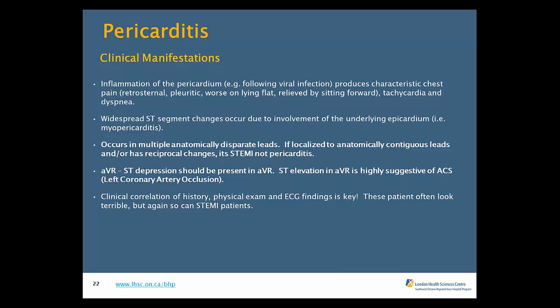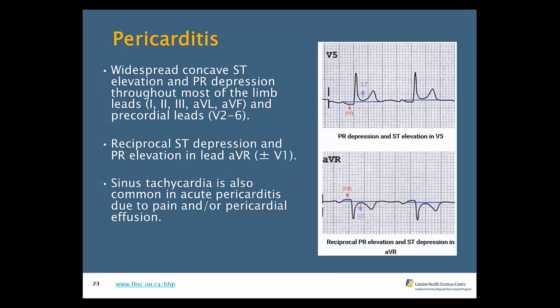The thing about pericarditis is it has evolving ECG changes. You can have a completely normal ECG and have signs of pericarditis, but over time that ECG does evolve. So it often depends at what point in their disease process you're seeing them and getting that ECG as to whether you have specific characteristics on it. Again, as Mike said, it's another cause of ST elevation, and I believe we'll go over a couple of pointers for recognizing pericarditis from ischemic ST elevation as well.